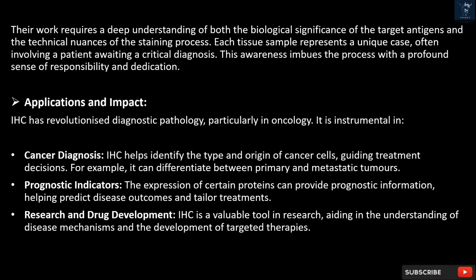Their work requires a deep understanding of both the biological significance of the target antigens and the technical nuances of the staining process. Each tissue sample represents a unique case, often involving a patient awaiting a critical diagnosis. This awareness imbues the process with a profound sense of responsibility and dedication. Applications and impact. IHC has revolutionized diagnostic pathology, particularly in oncology.